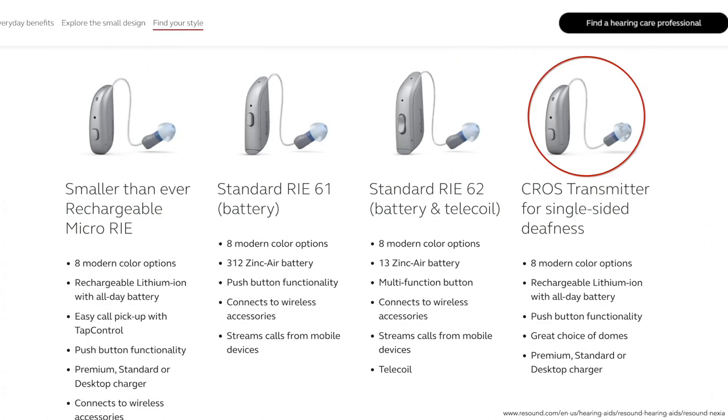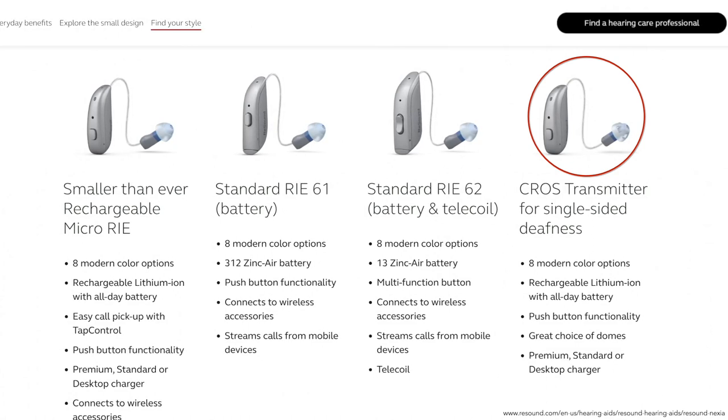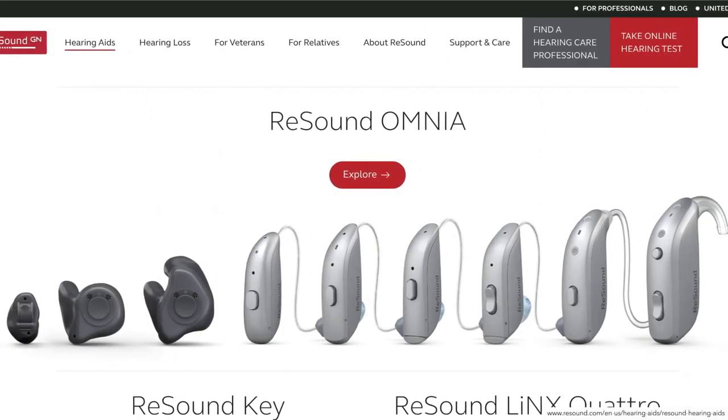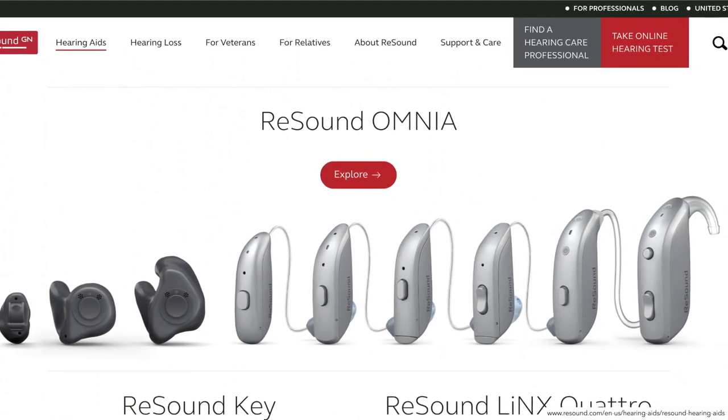The CROS transmitter for single-sided deafness is rechargeable, has a push button control, and wirelessly sends sound across the head to the opposite hearing aid. If you're looking for a hearing aid that's custom molded to fit inside the ear, consider the ReSound Omnia.